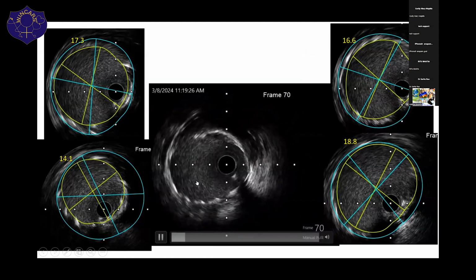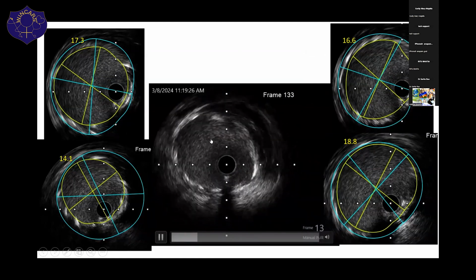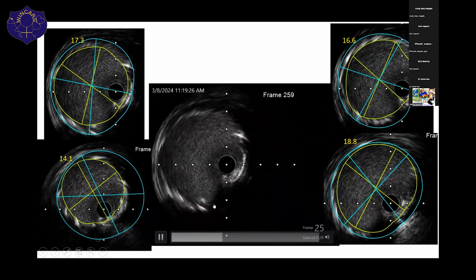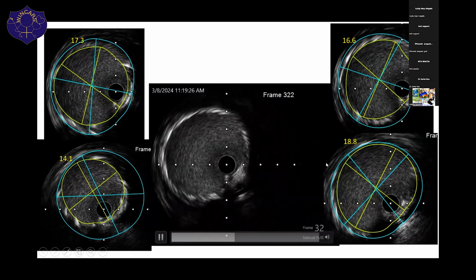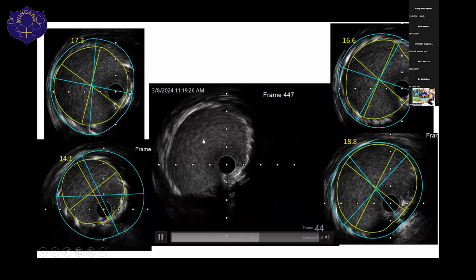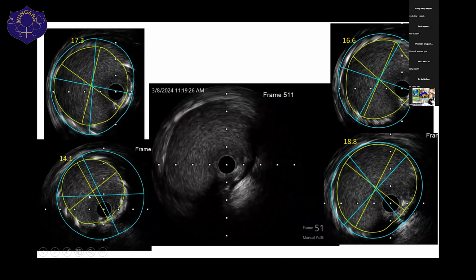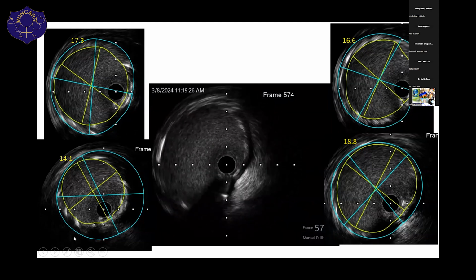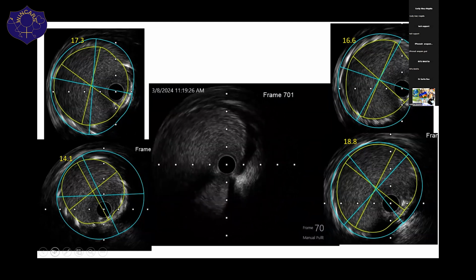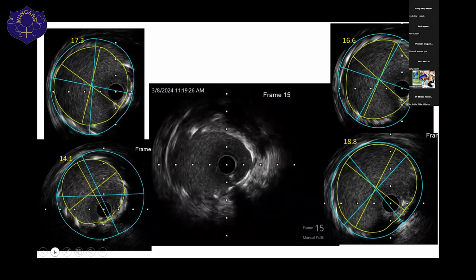And again, I come into the left main, I recheck because this is with IVUS, you can go in again and check, and you can see that I got very good MSAs, and the ostium of the left main is covered. And with these IVUS, we did not do any kissing balloon, because we concentrated on the left main and getting good MSAs.